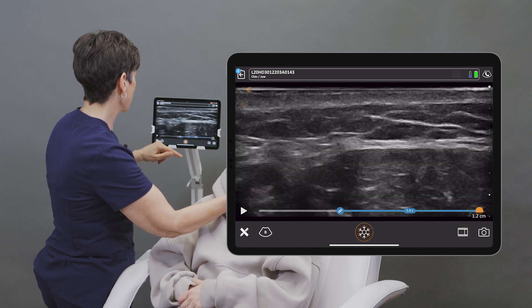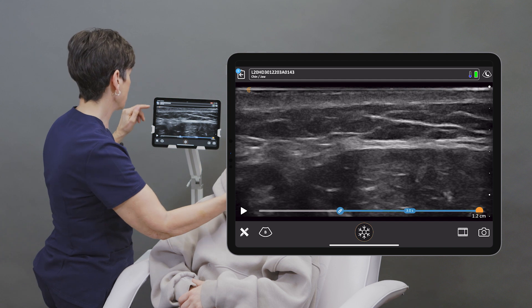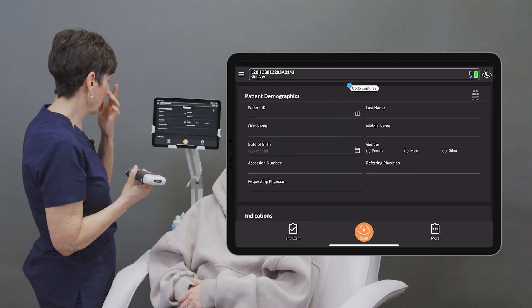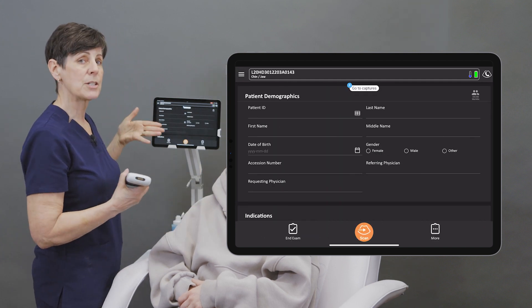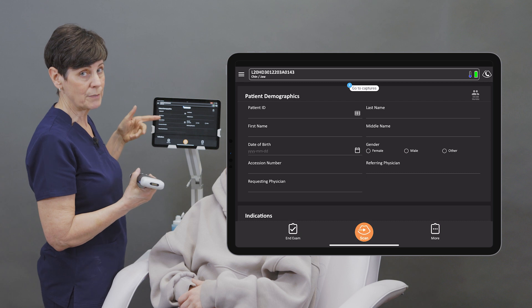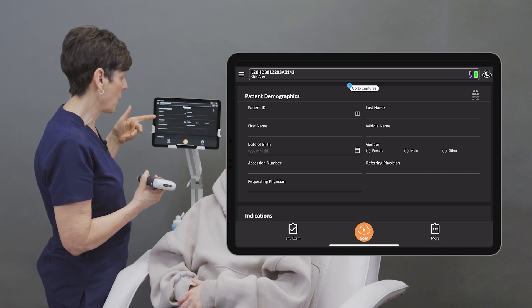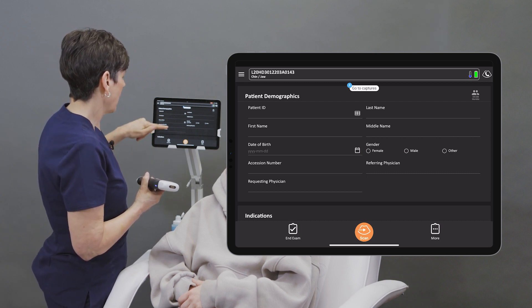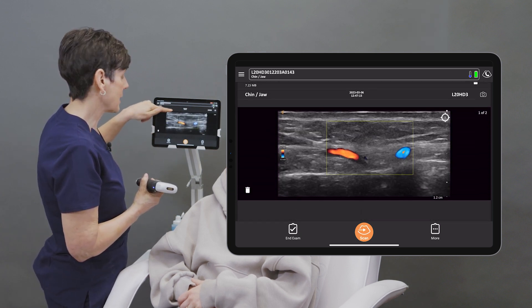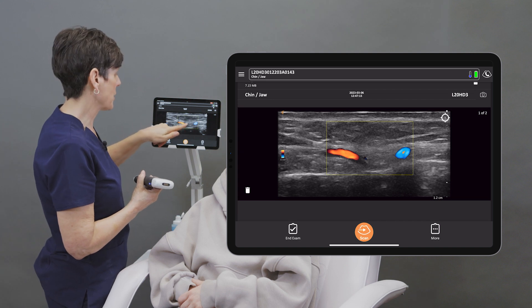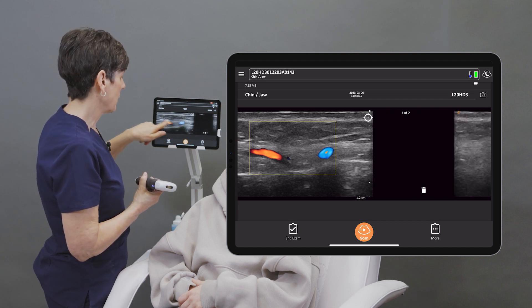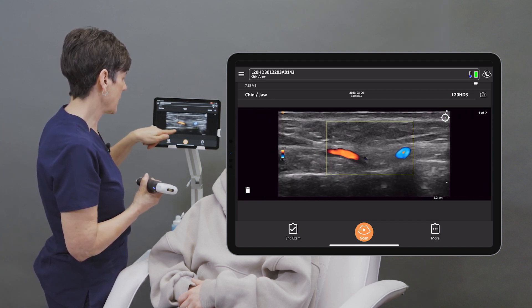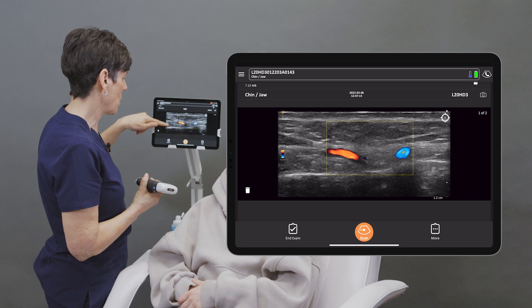So once I have stored all of my images and video clips, I can hit the back arrow. This takes me to the patient demographic page where I can enter all of the information that I want. I can swipe up to see the images that I've stored, where I can delete them if I want.